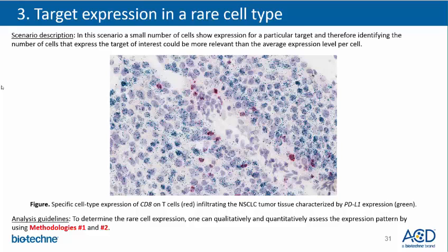However, in the case when very few cells are expressing the target, the average expression level might not necessarily be the most useful readout, but the number or percentage of, in this case, CD8 positive cells in the region of interest could be more informative.